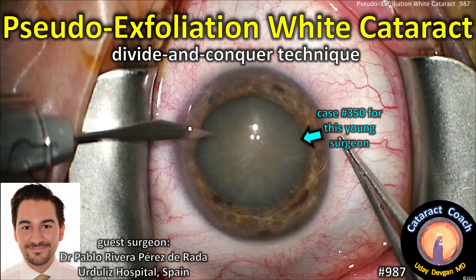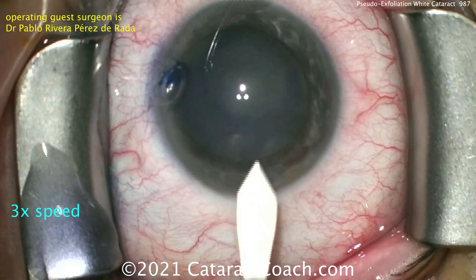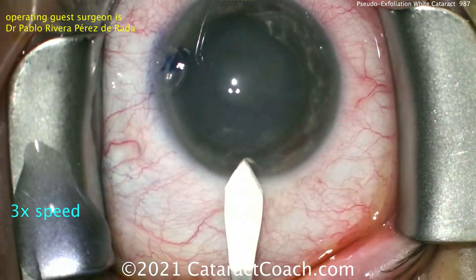CataractCoach.com. Pseudo-Exfoliation White Cataract with a Divide and Conquer Technique. It's case number 350 for our guest surgeon, Dr. Pablo Rivera Perez de Rada from Spain.